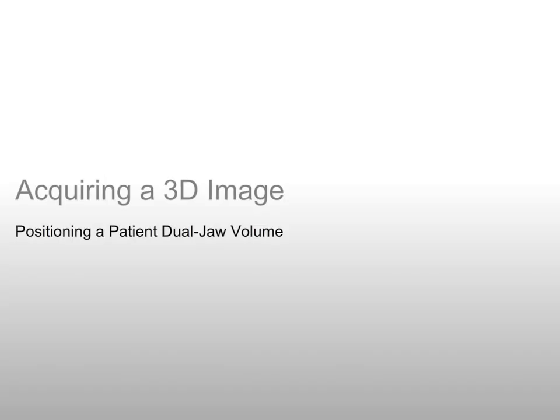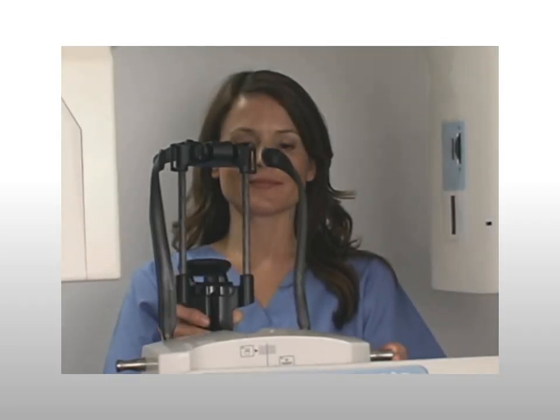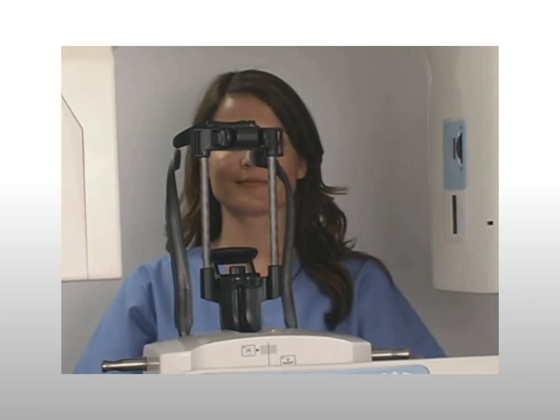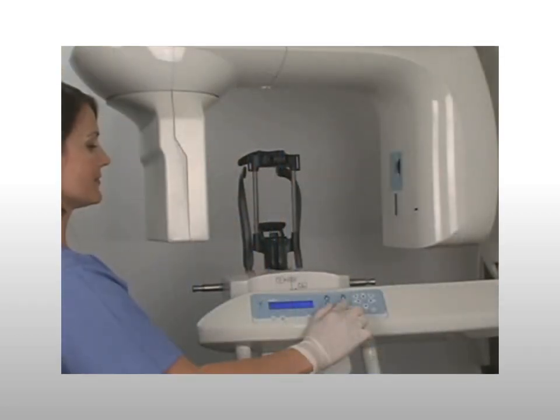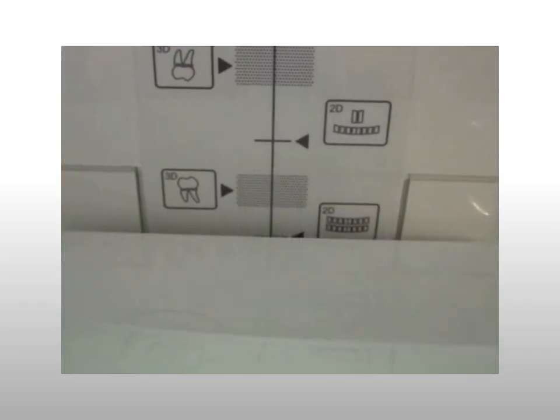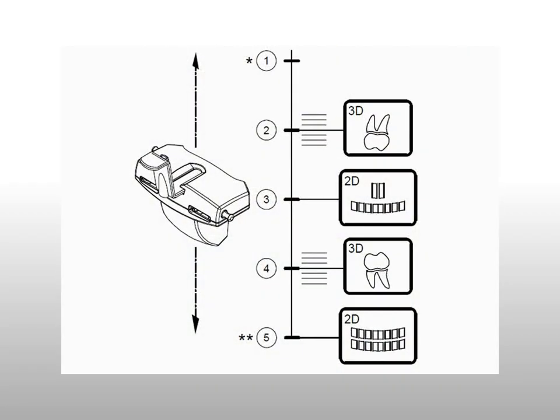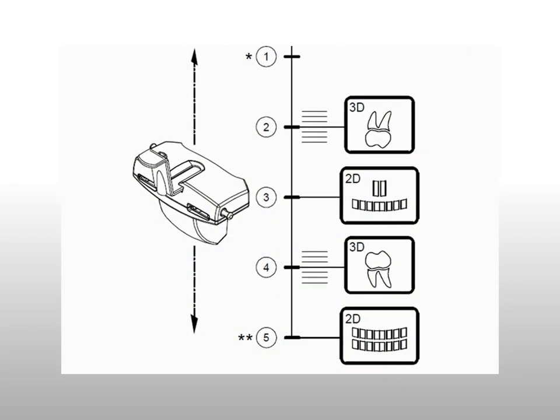Acquiring a 3D image: positioning a patient. Next, we will position a patient for a dual jaw volume. Insert the head support into the chin rest block — a click indicates it is locked into position. The head support is recommended for larger field of view exams. Use the 3D head adjustment button to adjust the chin rest according to the desired exam type, using the chin rest base positioning indicators as a guide.